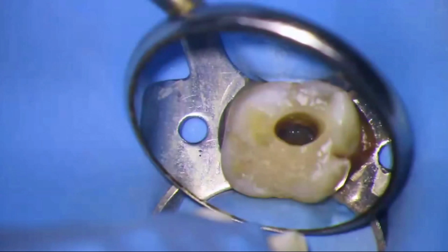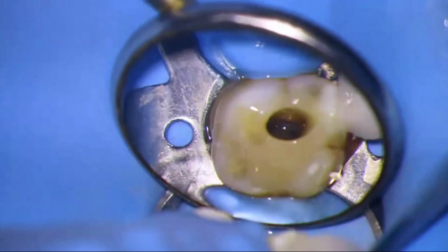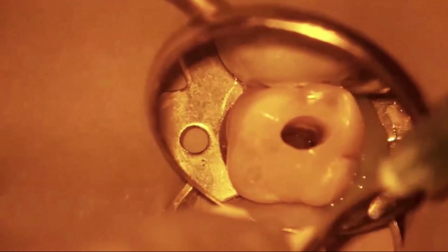And so what I have here is just a video of a case from last week. So we can see here that we have an access cavity, and what we need to do is just clean the tooth with some alcohol and then air dry to get it really dry. And the classic platform really just involves smearing a bunch of Sound Seal circumferentially around the tooth completely. It's a lot of material, but you want to have a really adequate seal.